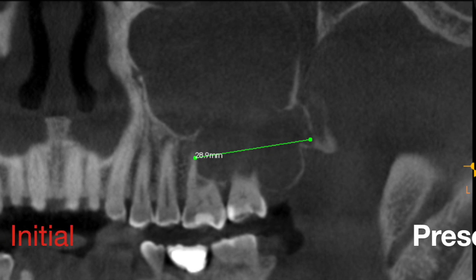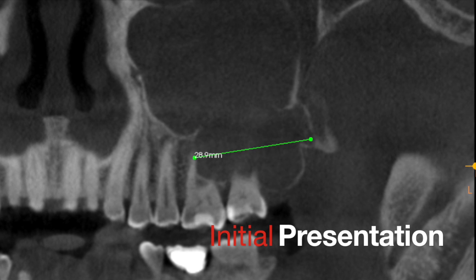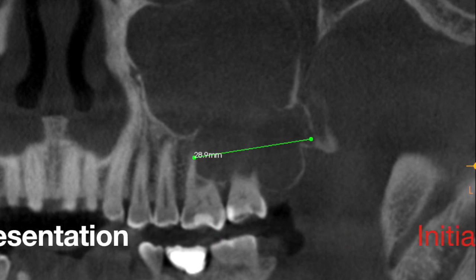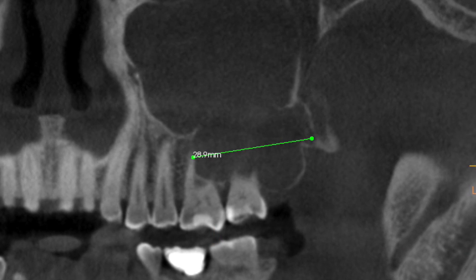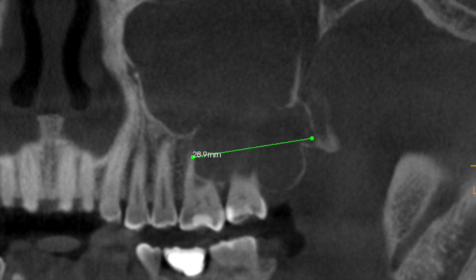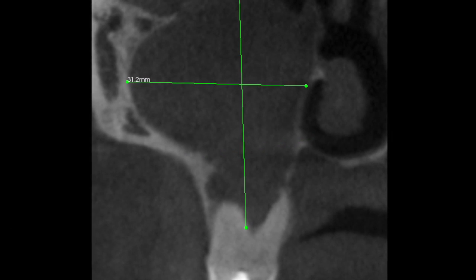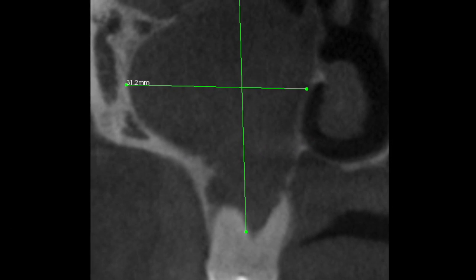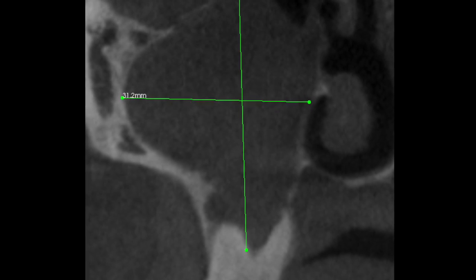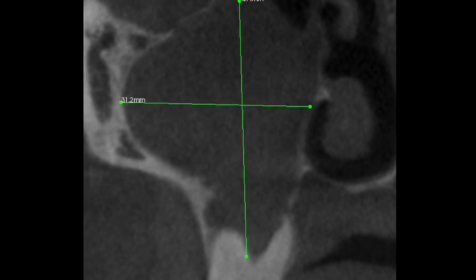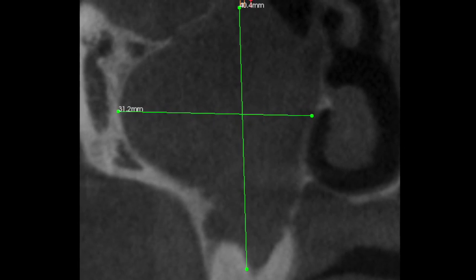Here we see the initial presentation of the cyst extending from the distal of the first molar to the tuberosity region and superiorly into the sinus, with either a perforation or perhaps an extremely thin border of bone.